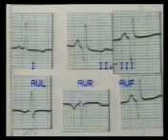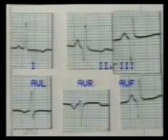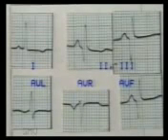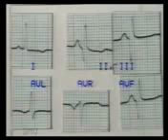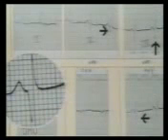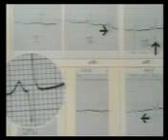In this ECG strip, note the deep Q waves in leads 2, 3, and AVF. The ST segment is isoelectric and there is no T wave inversion, so this is an old inferior wall infarct — at least 3 months old. Note in close-up view that the Q wave is deep as well as wide — a pathological Q wave.